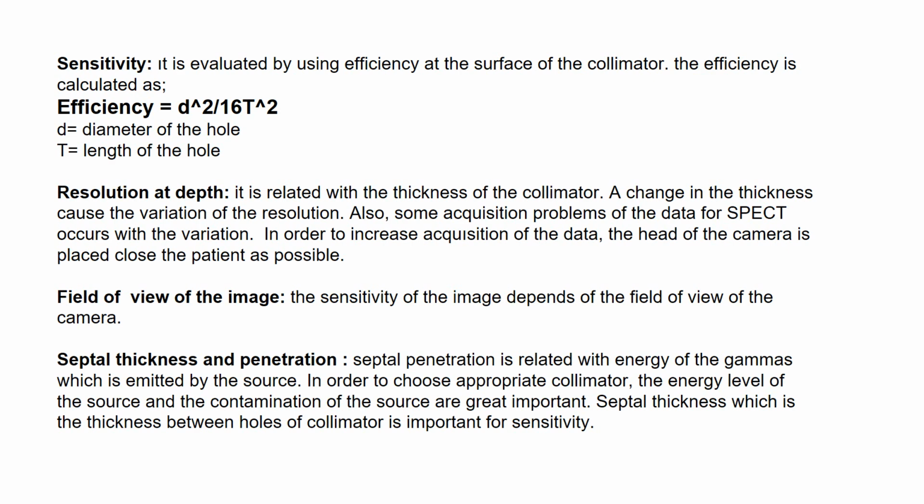The fourth parameter is field of view. The sensitivity of the image depends on the field of view of the camera. For example, in order to take an image of the whole body, the rectangular field of view camera is used.